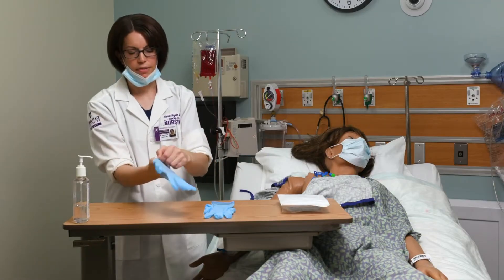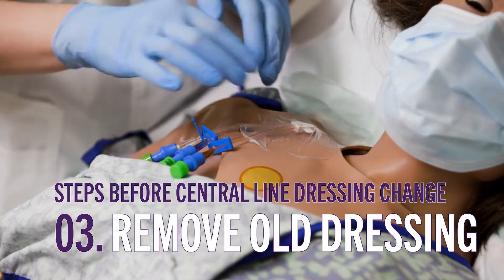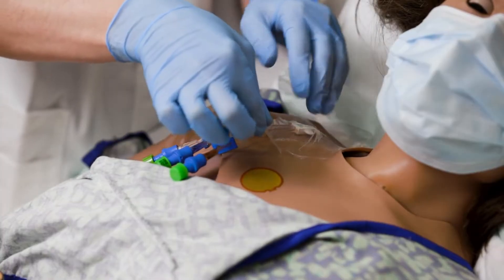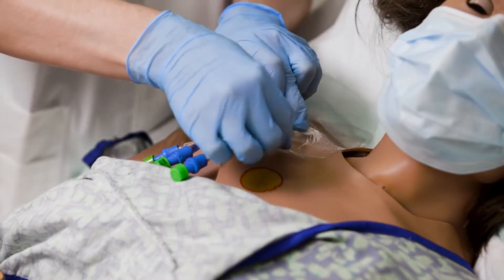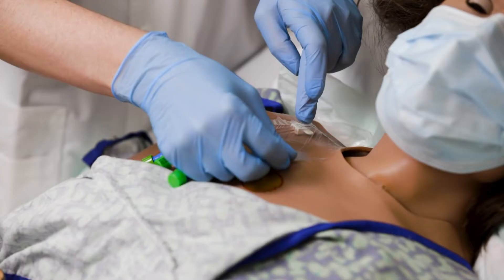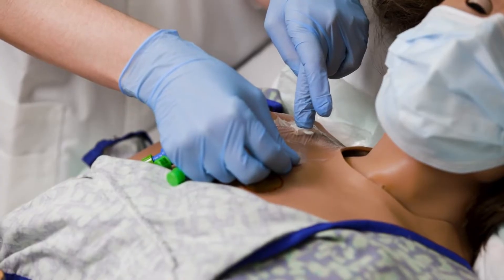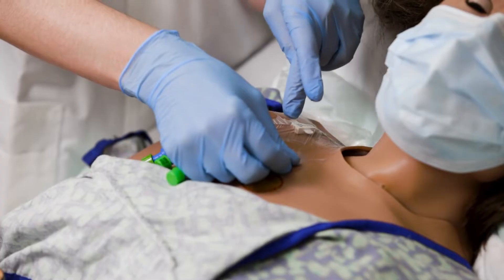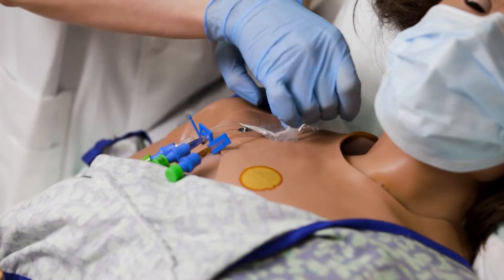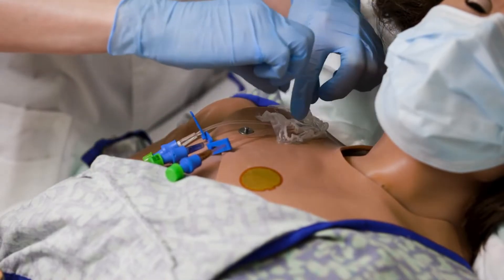I'm going to put my gloves on and then move to taking off the old dressing. As I'm doing that I want to look at the site to make sure it looks good and isn't red. To remove the Tegaderm, which can be pretty sticky, you can pull out on the dressing to help remove it. With my other hand I'm placing it right onto that line to stabilize it so I'm not pulling on the line as I remove the dressing. I'm checking for redness and making sure everything looks good, and I'm not touching the site.